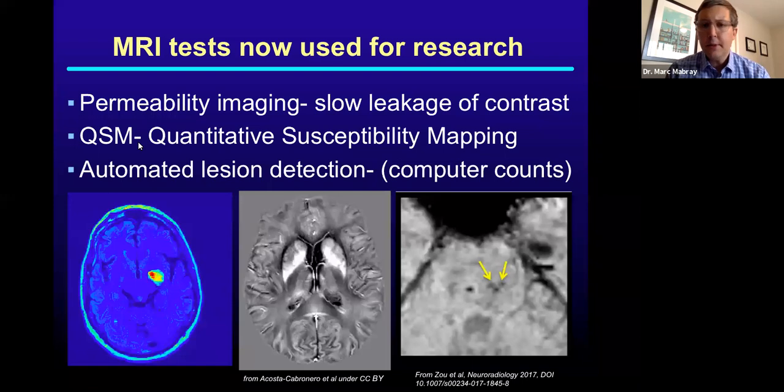I would think of that as being similar to susceptibility weighted imaging, except that it allows quantification of iron content. And since iron is in blood, the idea is that cavernous malformations that have bled are going to show increased iron content. Lots of heavy processing involved in that as well, and not something we're planning on doing clinically anytime soon. Another thing we've been working on is automated lesion detection, or essentially automated counting of cavernous malformations.